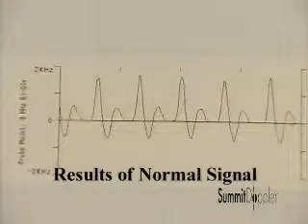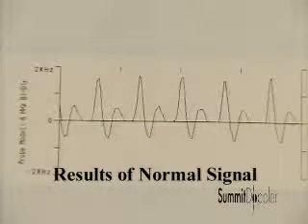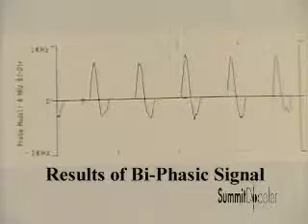The characteristics of waveforms acquired at the dorsalis pedis are similar. Here are examples of normal DP waveforms. This waveform is biphasic. The second forward flow component was not detected.